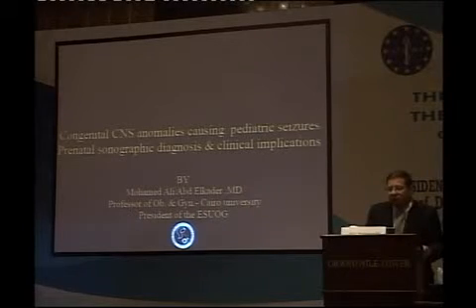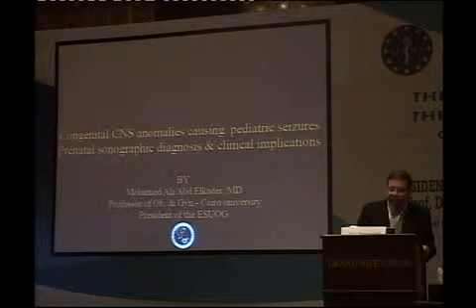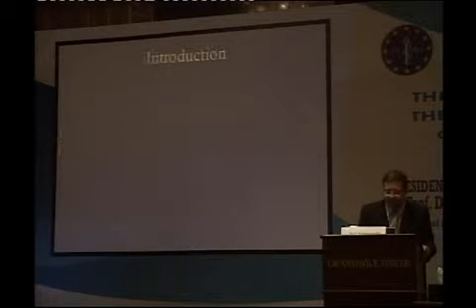Certain subjects are of clinical importance, and when a clinician reads a report, he should be fully aware of the fate of this baby. My topic today is congenital CNS anomalies causing pediatric seizures, prenatal sonographic diagnosis, and clinical implications.